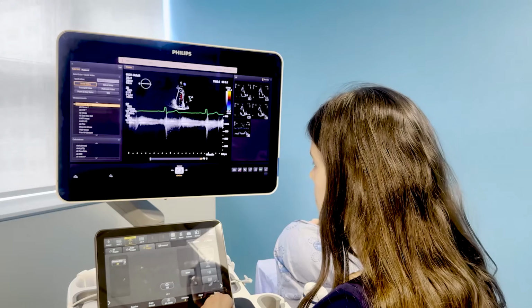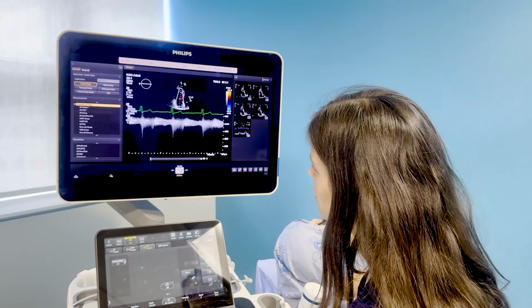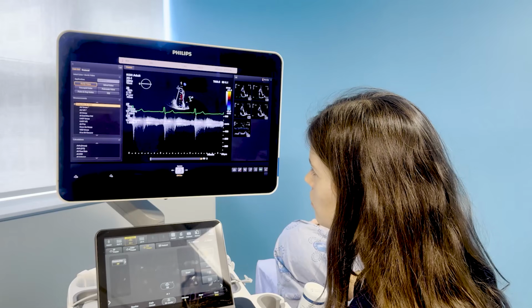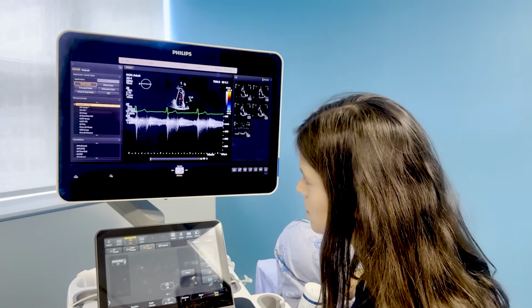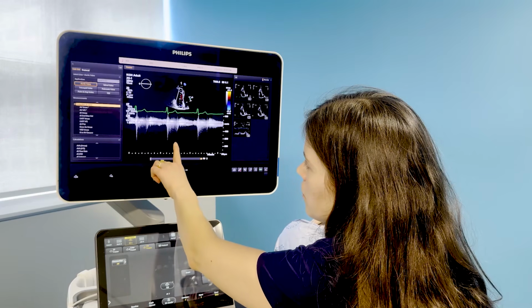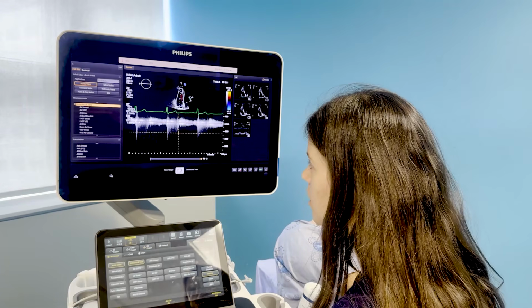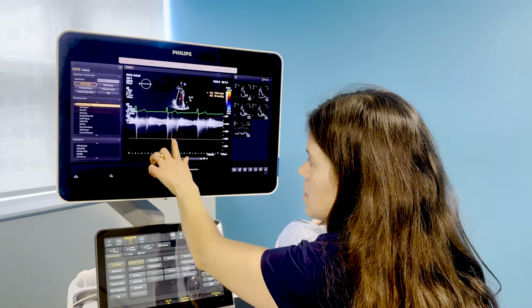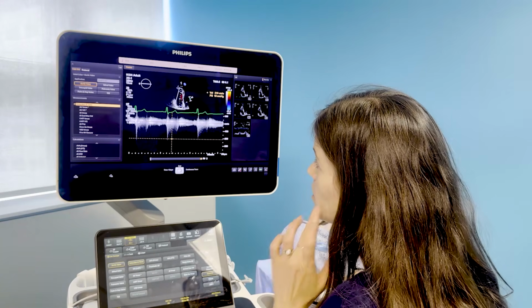And as you can see, Mateo doesn't have a lot of tricuspid regurgitation. We don't have a full spectral envelope here, so I wouldn't measure this. If he did have a full envelope, you want to measure just right at the tip of it. If you can imagine, it might be something like this. Right. But I wouldn't use this to measure his pulmonary pressure.